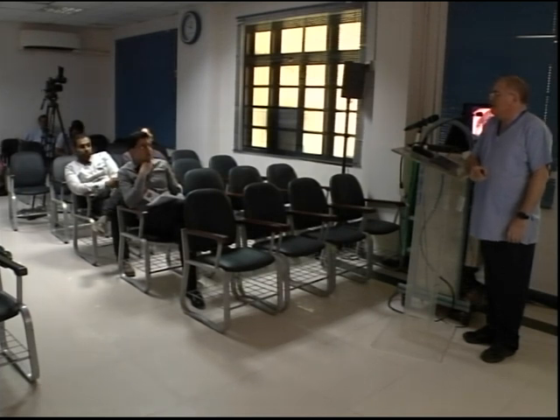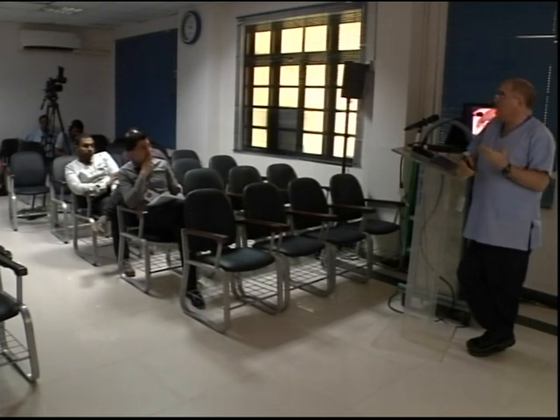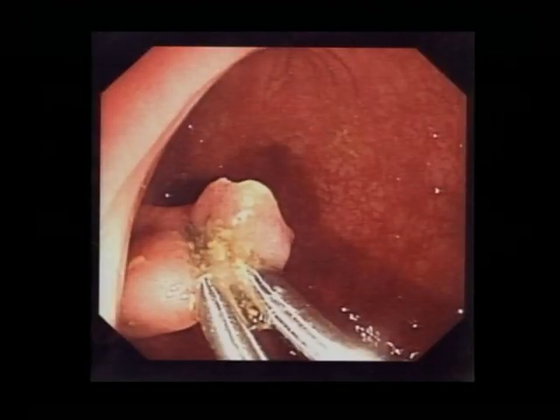Should it show signs of bleeding, I open the snare, drop it over, and I tamponade it. I don't close it too tight, I just tamponade it. Wait, and then stare at it. Chat. How's the weather? And then I think, what should I do next? Is it another clip? Is it an injection? So it gives you time to think.